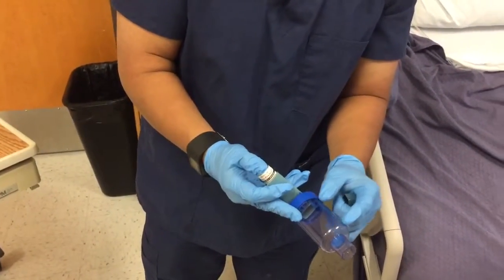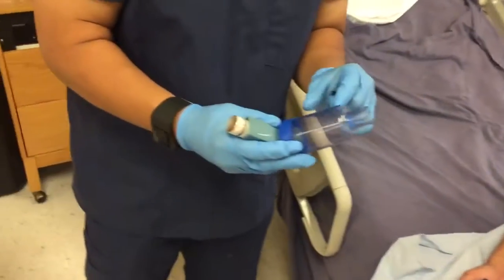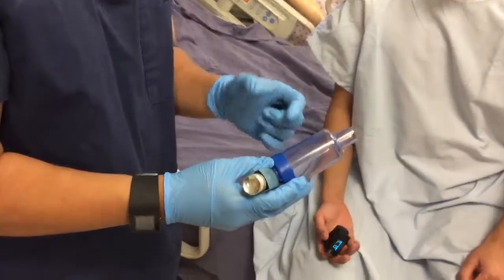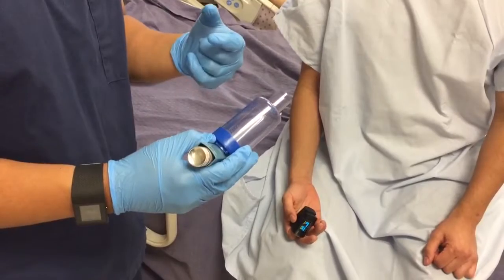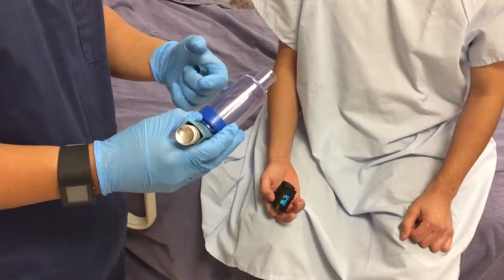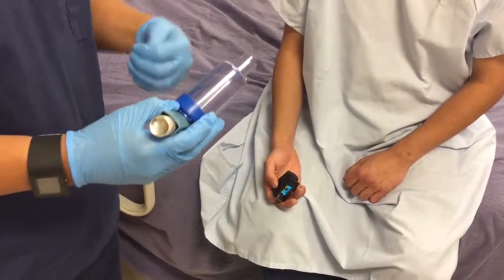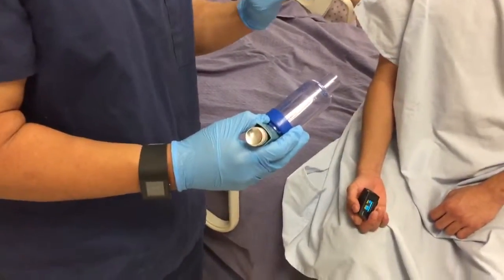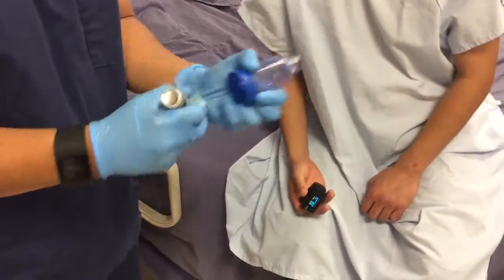It'll capture the medication in here, and then from here you can breathe it in. There is a whistle to this, so if you're inhaling too deeply or too quickly, it will signal you to slow down a little bit. By doing that, it helps get the medication to where it needs to be. Otherwise, it may wind up where it doesn't really help you. So if you don't mind putting it together for me.